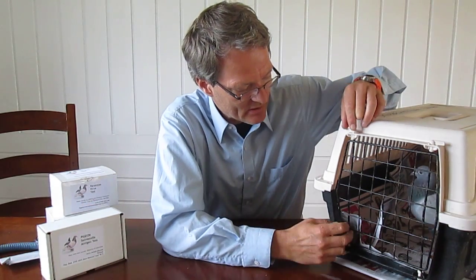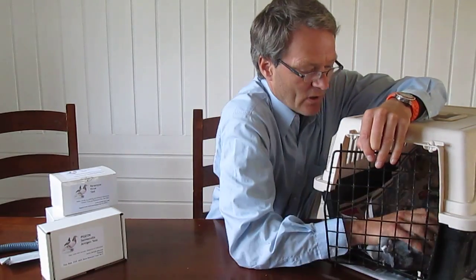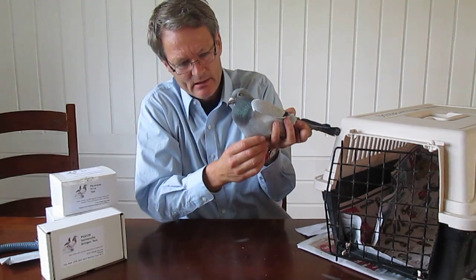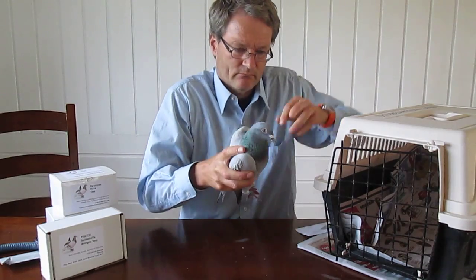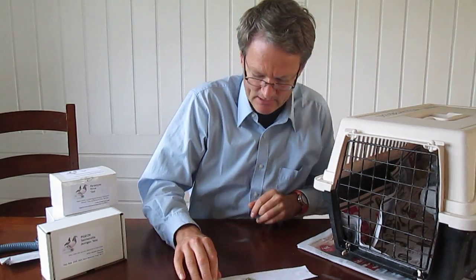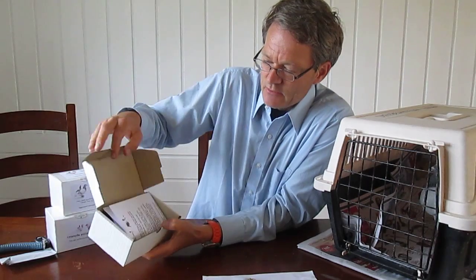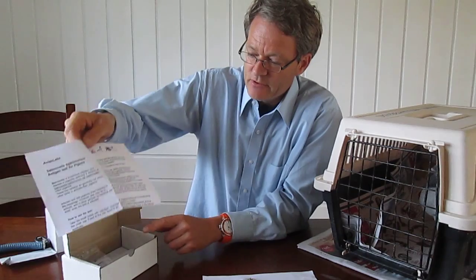This is a quite expensive Dutch pigeon. It was sick for a while, it is quite thin, and it had loose droppings, but otherwise it was quite fine. We want to test it, and here we have collected some droppings. The test is quite easy to perform.